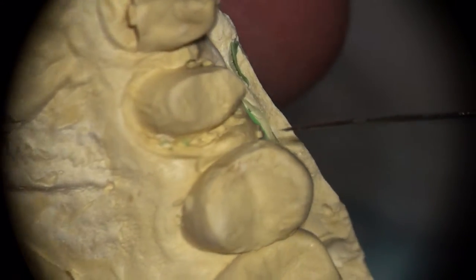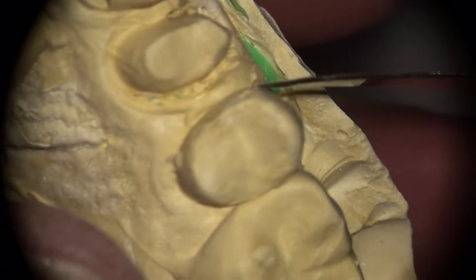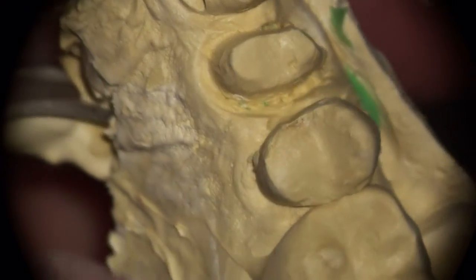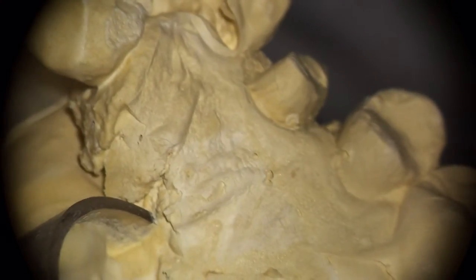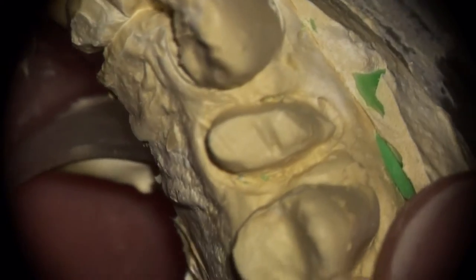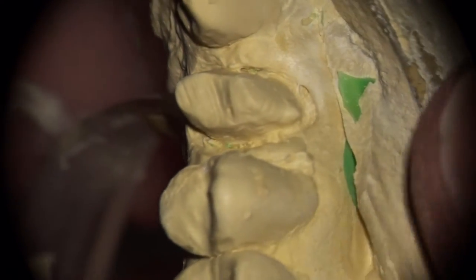Looks like puffy gums here on the adjacent tooth. And it's subgingival and equigingival. Some drags and bubbles and stuff, so this one's going to take us some extra time.